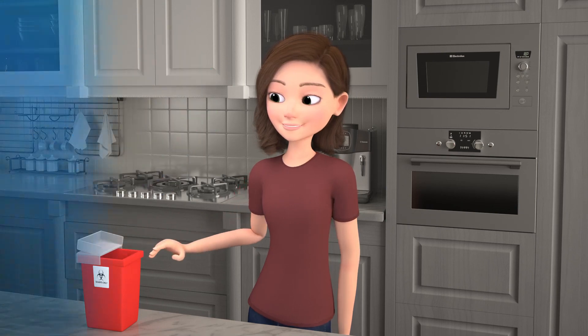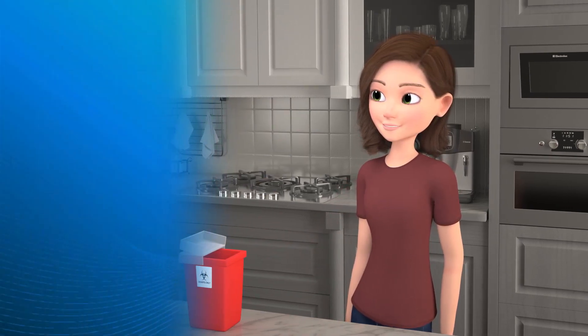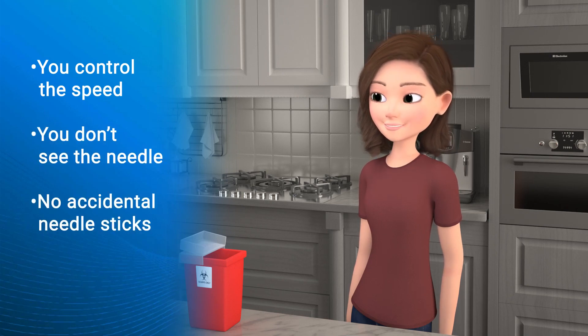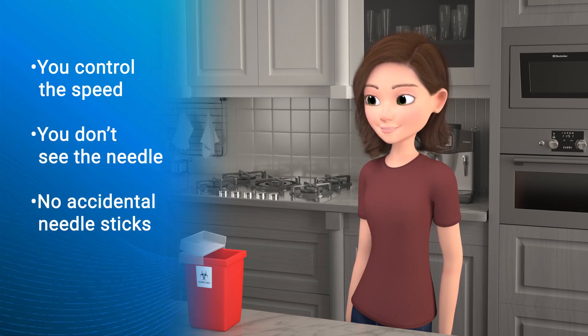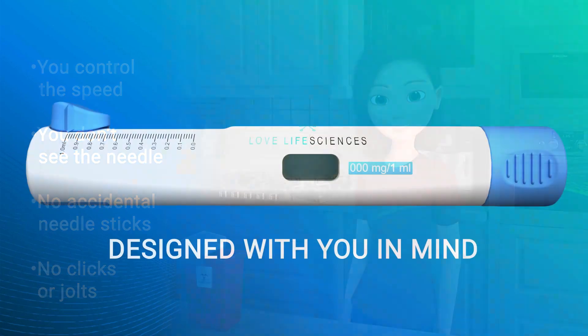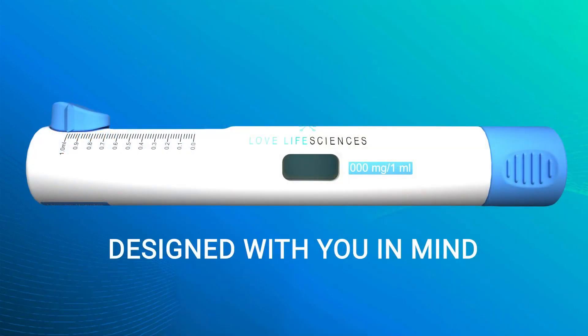You can now dispose of your UniPen. And that's it. You control the speed of the entire process. You never have to see the needle or worry about extra steps to prevent accidental needle sticks. And you don't have to deal with anxiety-provoking clicks or jolts like other devices. UniPen — designed with you in mind.